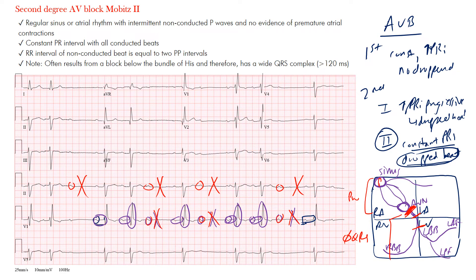The big difference from first degree is that there are dropped beats — in first degree there are no dropped beats. To differentiate: constant increased PR interval with no dropped beats is first degree AV block; progressive PR lengthening with a dropped beat is Mobitz type 1 (Wenckebach); constant PR interval with intermittent dropped beats is Mobitz type 2, which we're seeing here.